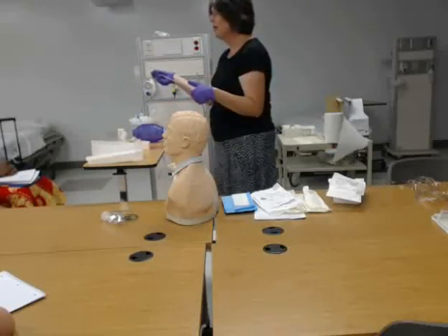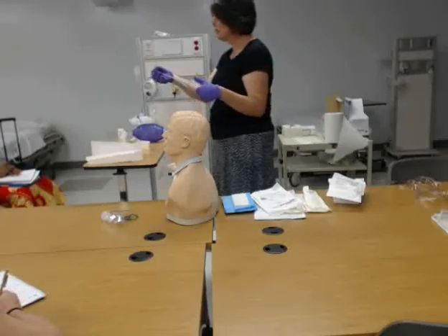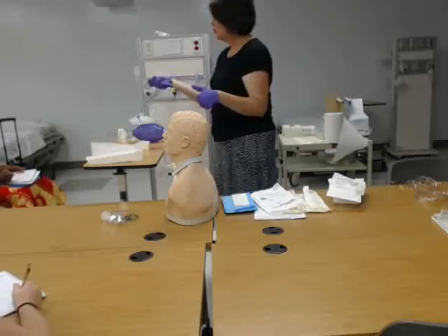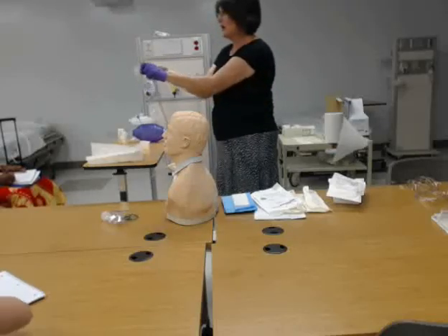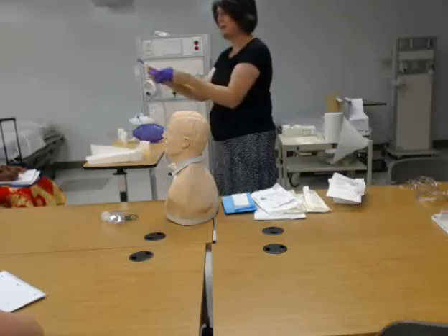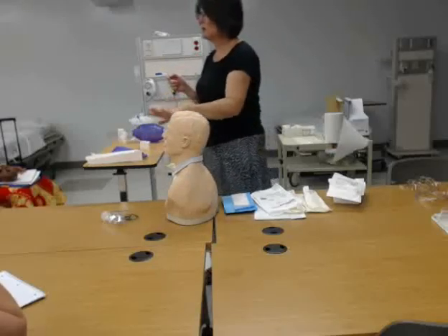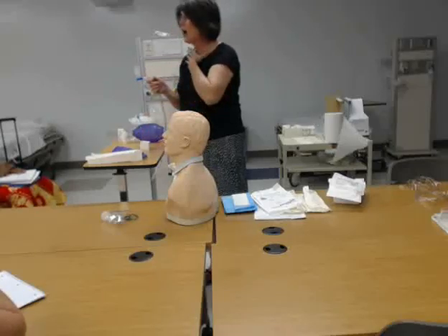The book says no more than 5 to 15 seconds, and you can understand why — because if you're suctioning you're pulling out the oxygen, so you don't want to stay camped out there for a long time; that's not good for your patient. When you're all done, just loop the catheter up in your hand, put your glove inside out over it, then take off the second glove and throw everything away. You want to keep looking at your patient. A lot of times you may need to hook them back up to their oxygen or their humidity mask — the collar that they wear.